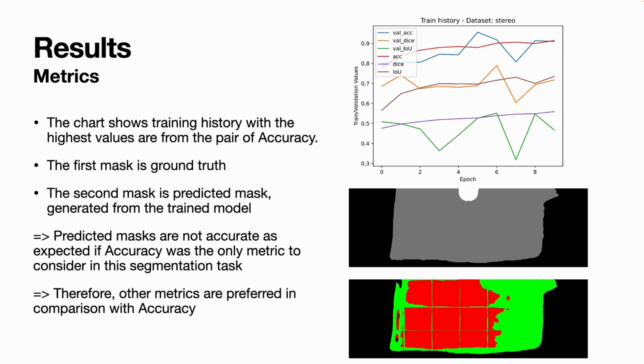The reason is that when in an image there are, let's say, 5% of class 2 and 95% of non-class 2, then when the accuracy says 95% is correct, this might mean it correctly guessed the non-class 2 pixels only. Therefore, a better metric for the image segmentation task should be used.